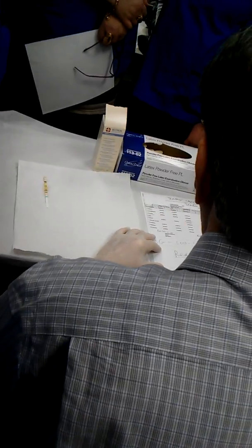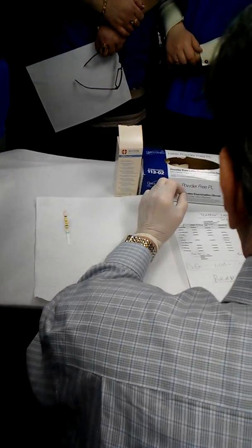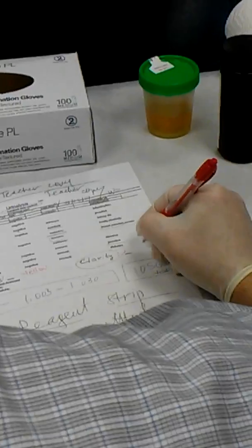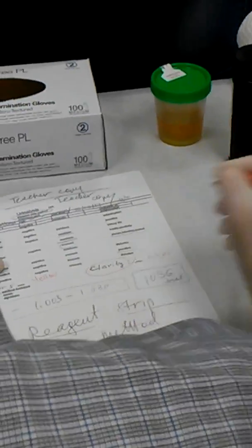Then you see you have these two things, color and clarity. I will explain later. This is a physical examination of the urine, color and clarity. What is color? Yellow. You write yellow. Clarity, clear. So you write clear.